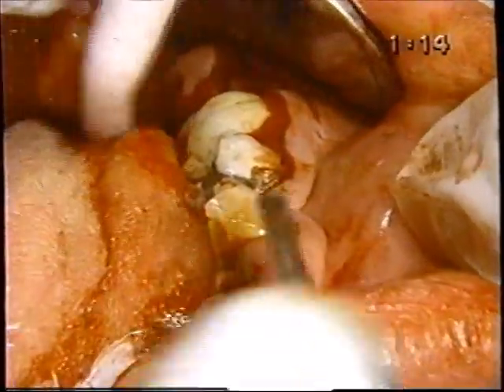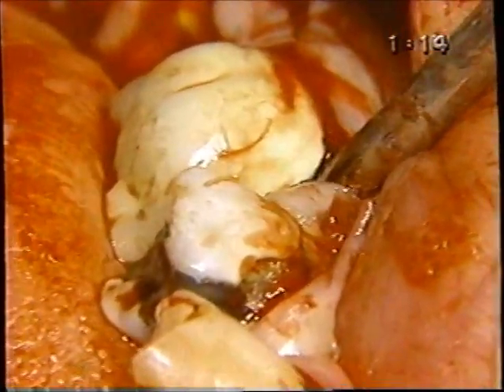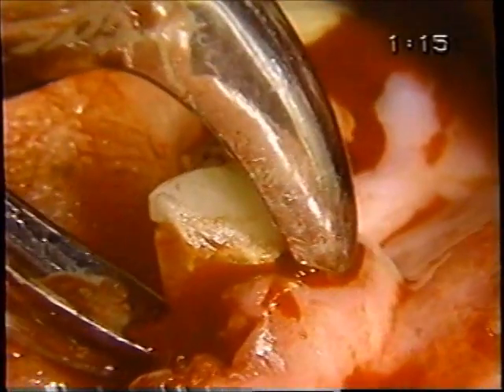This one we can't use the 301 on, obviously. It'd be very difficult to engage bone there. There's nothing to engage against. So we'll depend totally on a forceps for luxation and elevation there. Actually, I'm sure we're using that other tooth as a fulcrum. But in this case, it doesn't matter since it's going to be removed. So we'll go buccally. But we have to be careful. With that thin bone, it could fracture out a large section lingually.